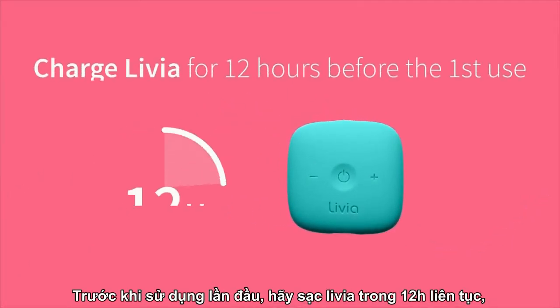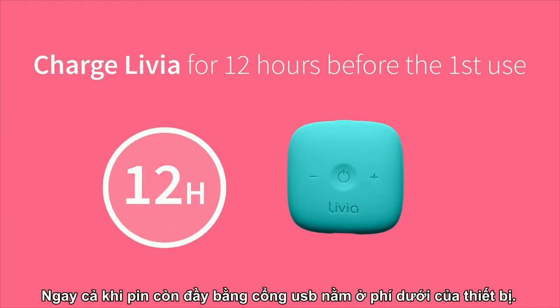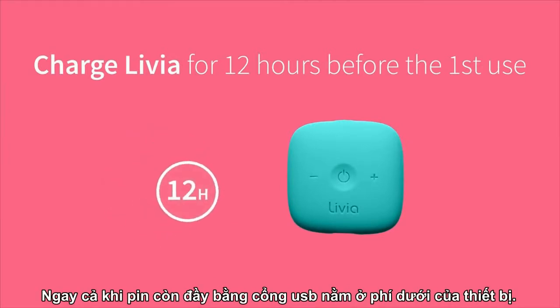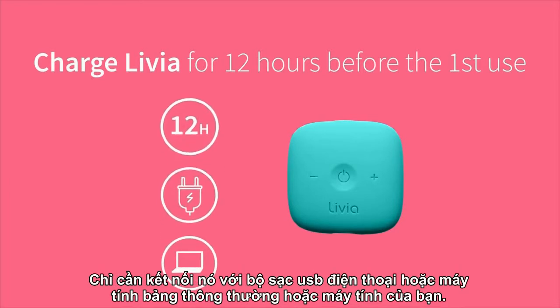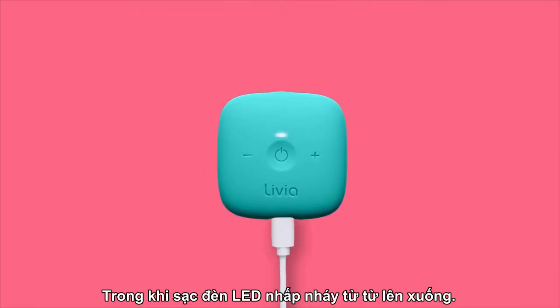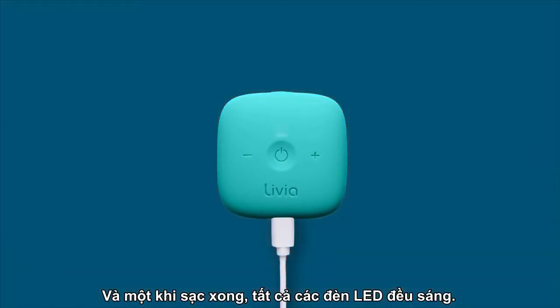Before the first use, charge your Livia for 12 hours strict, even if it is already charged, using the USB port on the bottom of the device. Just connect it to a regular phone or tablet USB charger, or to your computer. While charging, the LED lights flash slowly up and down, and once charging is completed, all LED lights remain lit.